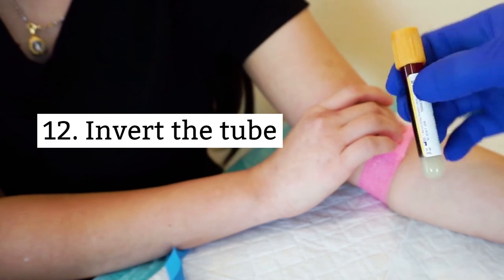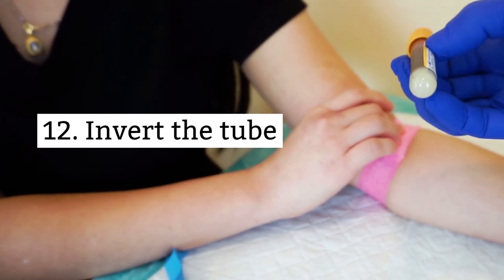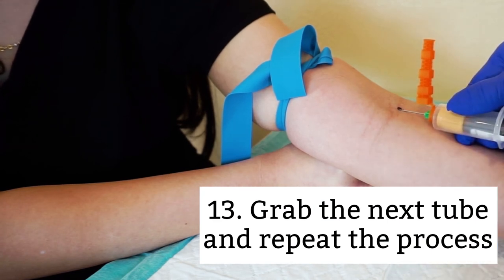Twelve, remove, then gently invert the filled tube a few times to prevent blood clot. And I said gently because you do not want to cause the blood to hemolyze. Thirteen, grab the next tube and repeat the process until you have collected all the blood that you need.